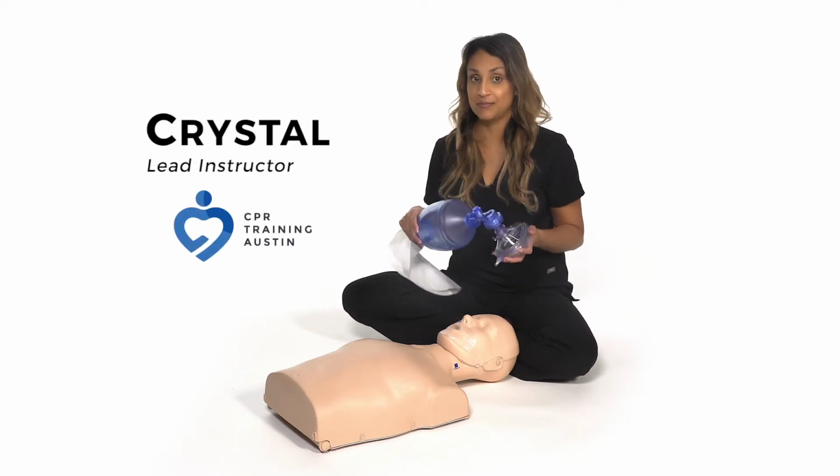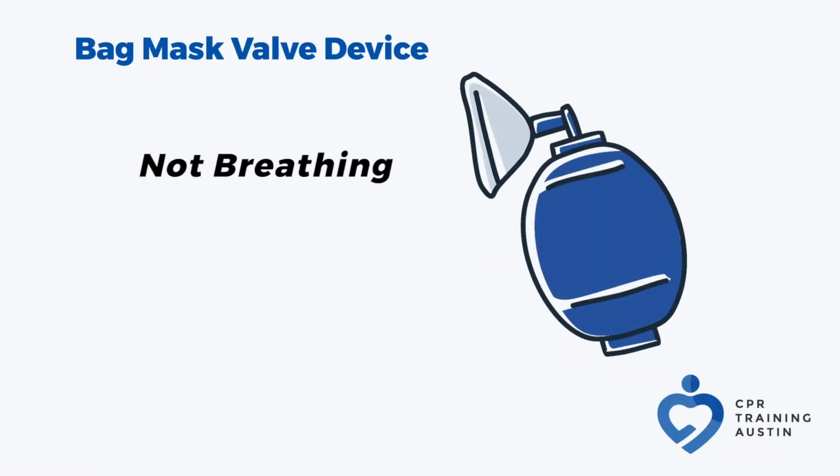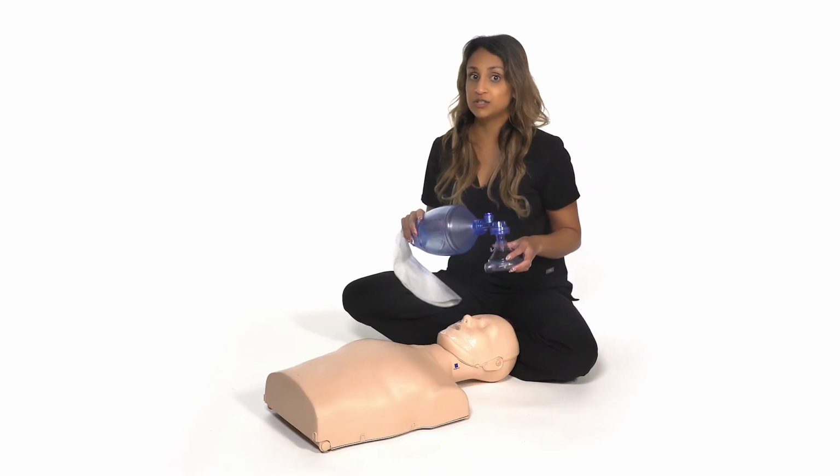Today we're going to discuss the bag mask valve device. A bag mask device is used when a patient is not breathing or they aren't breathing adequately. It's often used in two rescuer CPR or during rescue breathing.